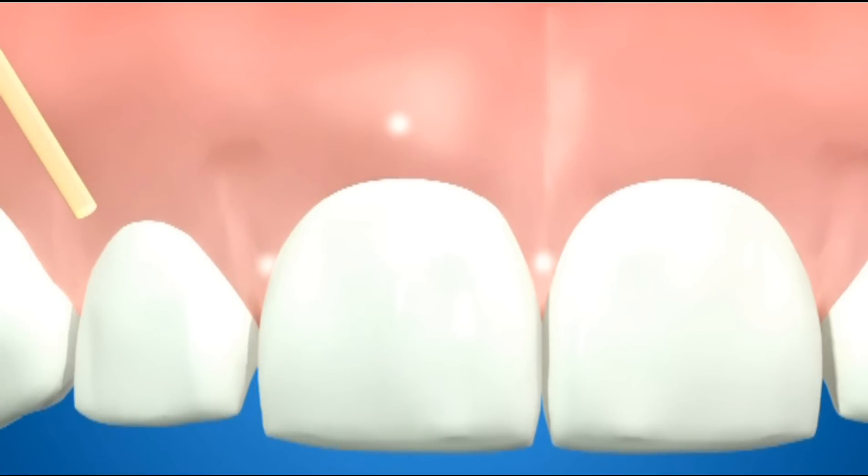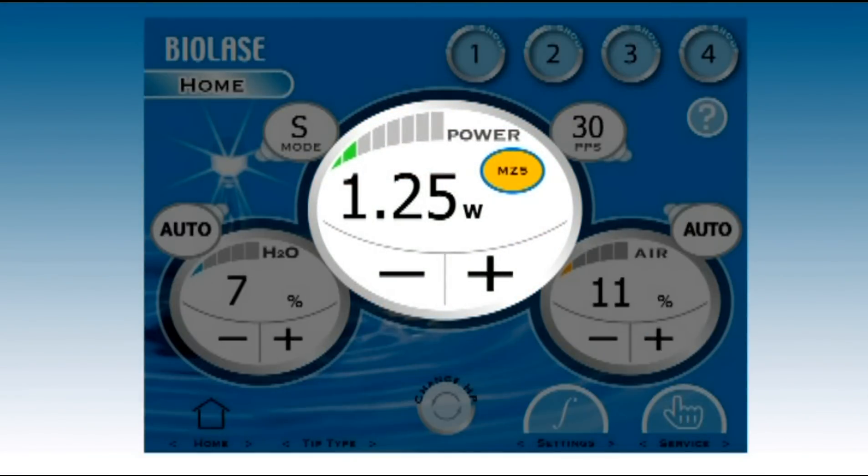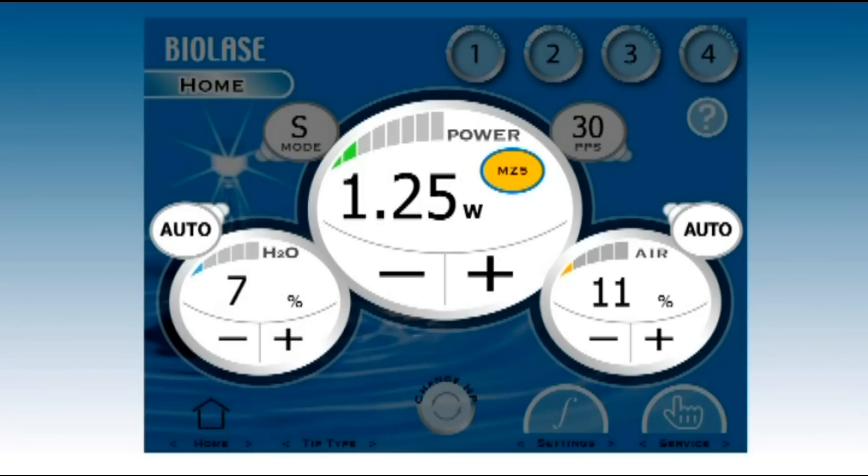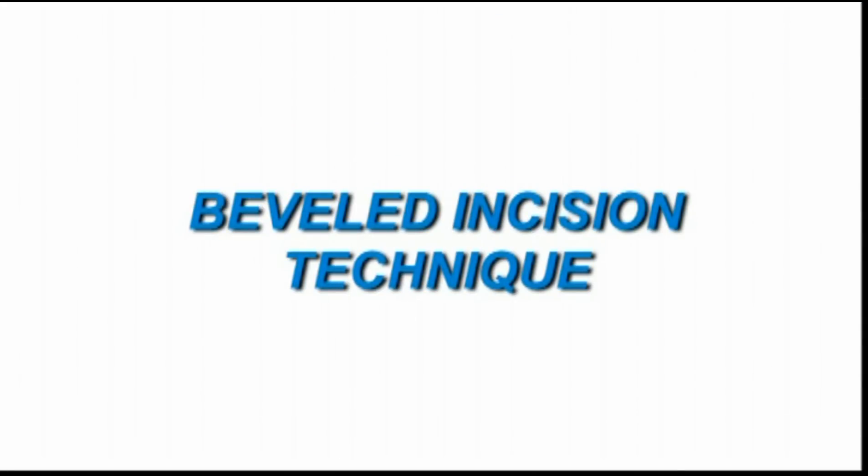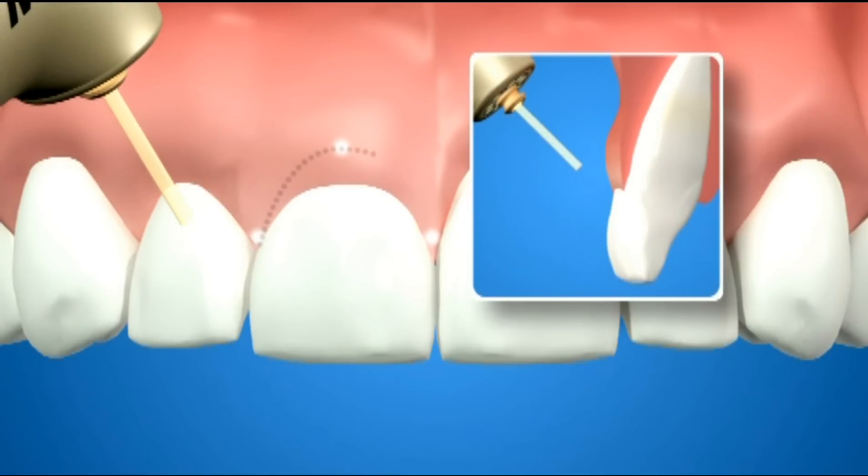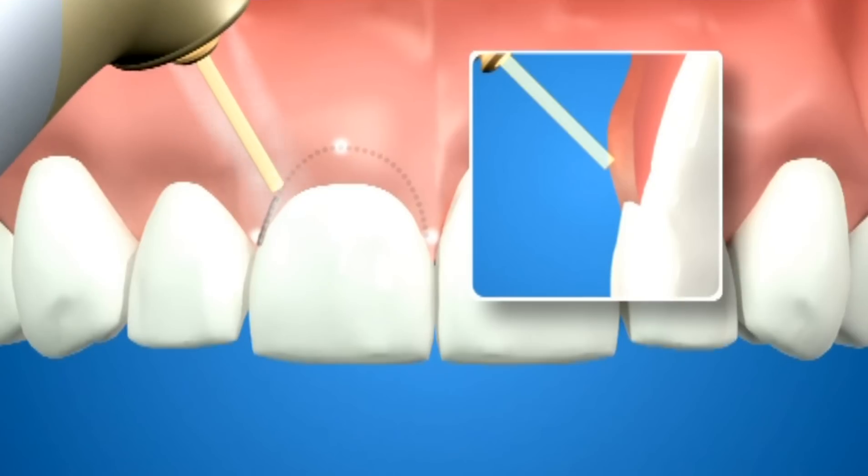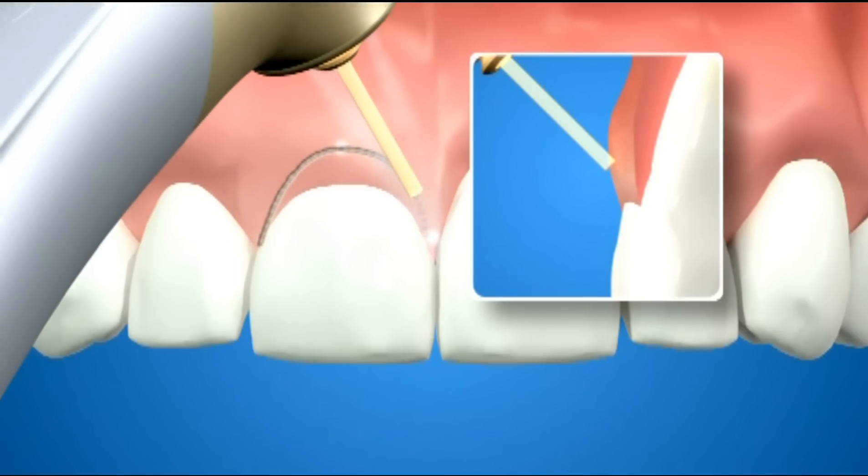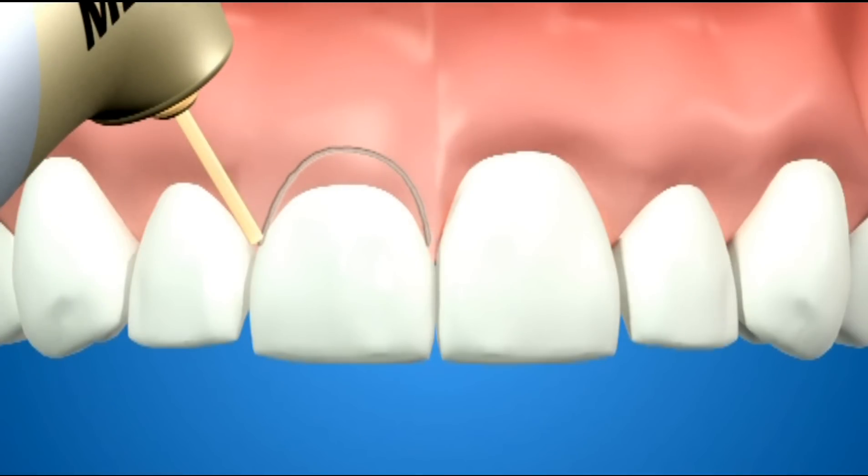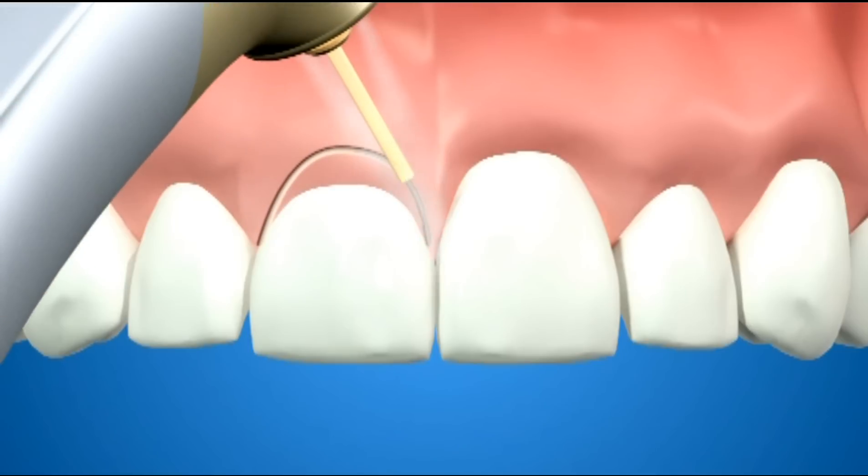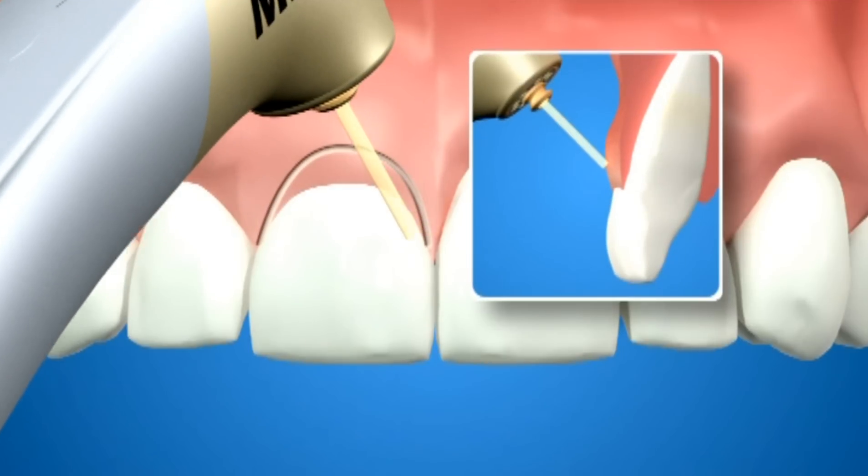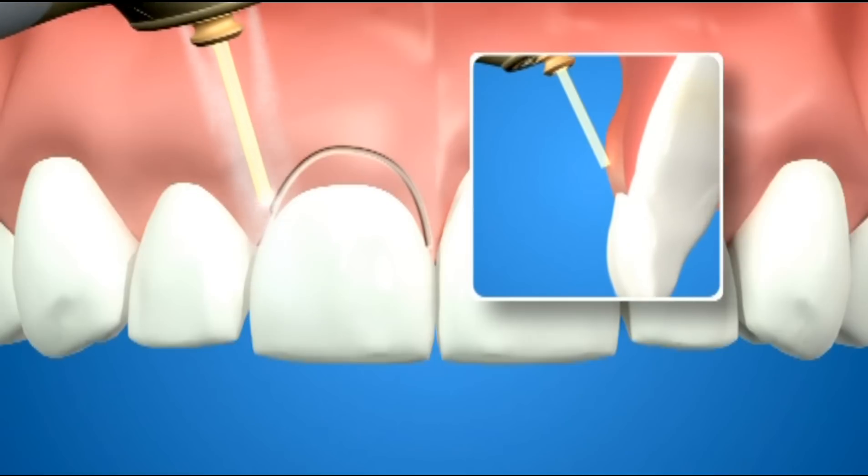Now let's make the incision. Increase the power to 1.25 watts, the air to 11% and water to 7%. Set frequency to 30 hertz and pulse mode to S. For thin gingival biotypes, use the beveled incision technique. Place the tip in light contact with the tissue at a 45 degree angle. Activate the laser and cut along the marked outline. Cut across the arch one layer at a time, making as many passes as necessary. Just before cutting through the gingiva, angle the tip almost parallel to the tissue to avoid the tooth surface.